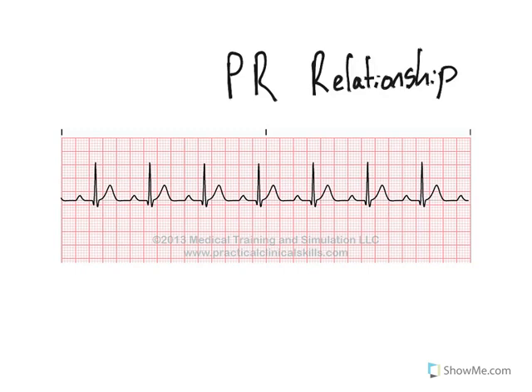And so you're looking at this, and this is not really a heart block, right? This is a first degree AV conduction delay. Normally what I expect to happen, what I would like to see, is I would like to see if I'm starting my P wave, right? And remember, when we're talking about an interval, like PR interval, then we're talking about the wave itself, okay? So the P wave is inside that PR interval, okay? And what we expect to happen is we expect the R wave to fall within that exact same big box, okay?